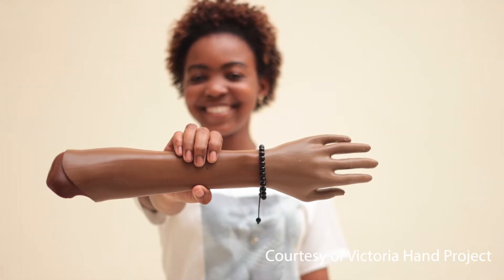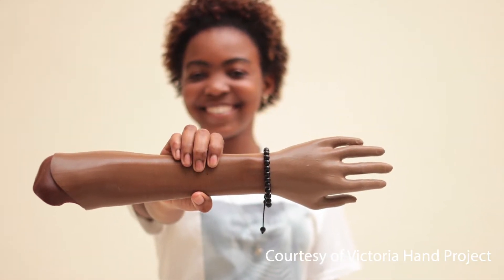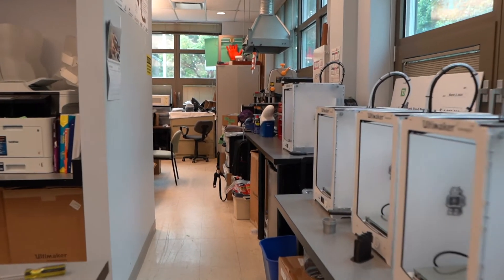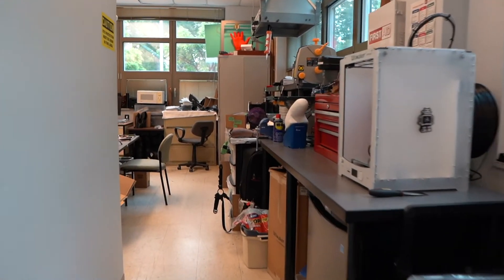The Victoria Hand Project is a Canadian charity organization that designs and deploys low-cost 3D printed prosthetic arms for low-income communities around the world. We develop the technologies, the 3D printed prosthetic arms, the workflows, and we partner with clinicians in low-income communities and transfer them the technology so they can produce these low-cost prosthetic devices themselves.